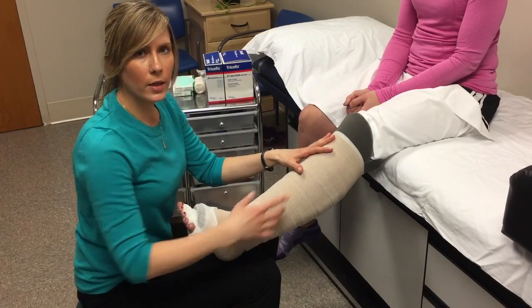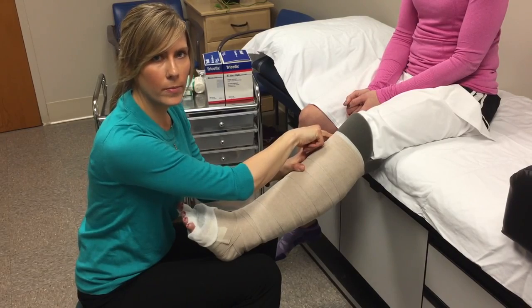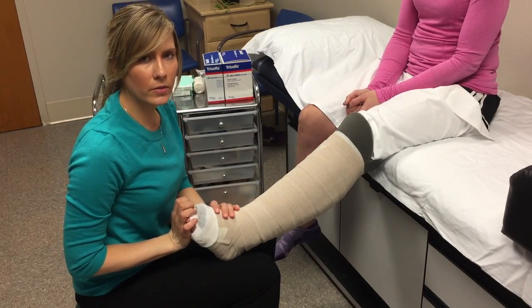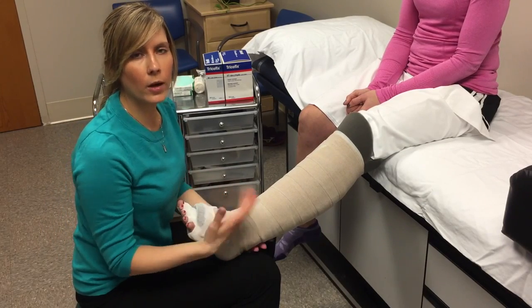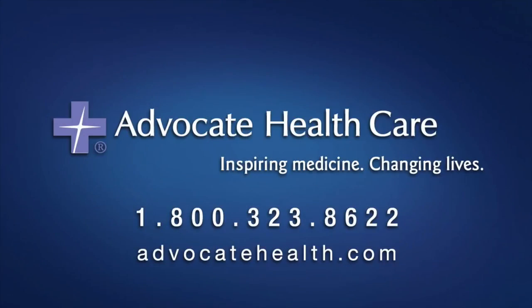Now you're done with the bandaging. It's okay to go ahead and trim the upper part of the foam, and make sure that the patient doesn't feel any numbness or tingling in the feet and is able to fit in a shoe and walk around comfortably. And then you're all set. This is a good workout. Thank you.